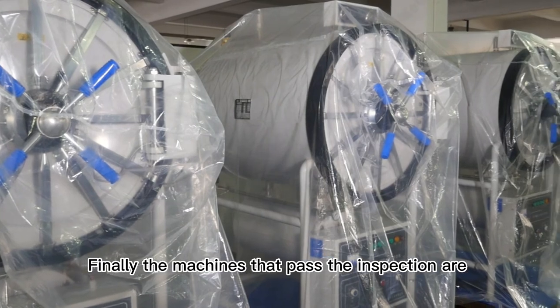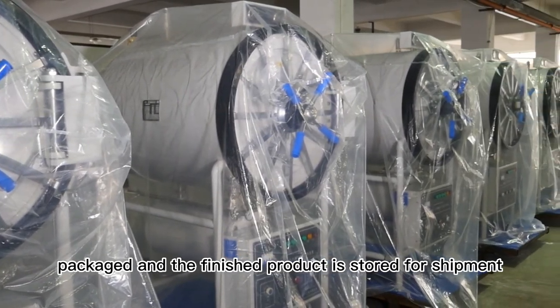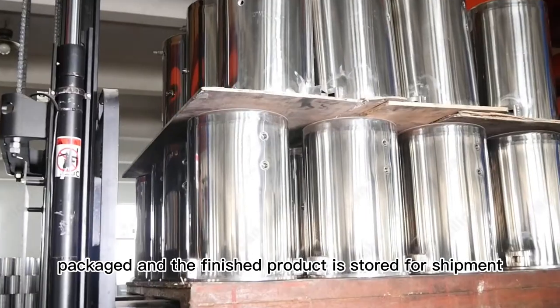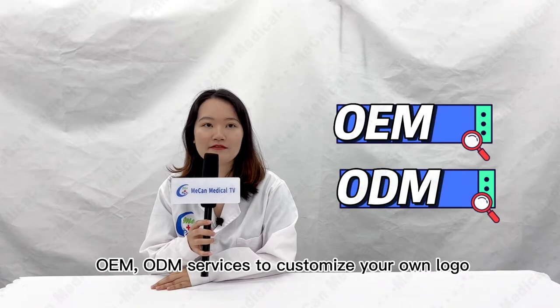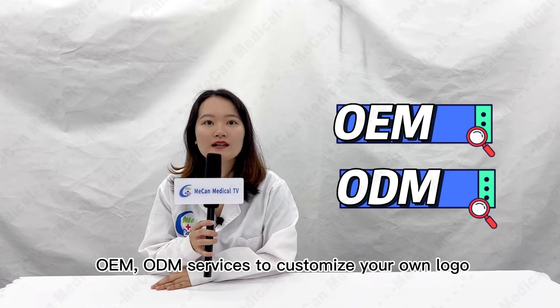Finally, the machines that pass the inspection are packaged and the finished product is stored for shipment. By the way, we accept OEM and ODM service to customize your own logo.